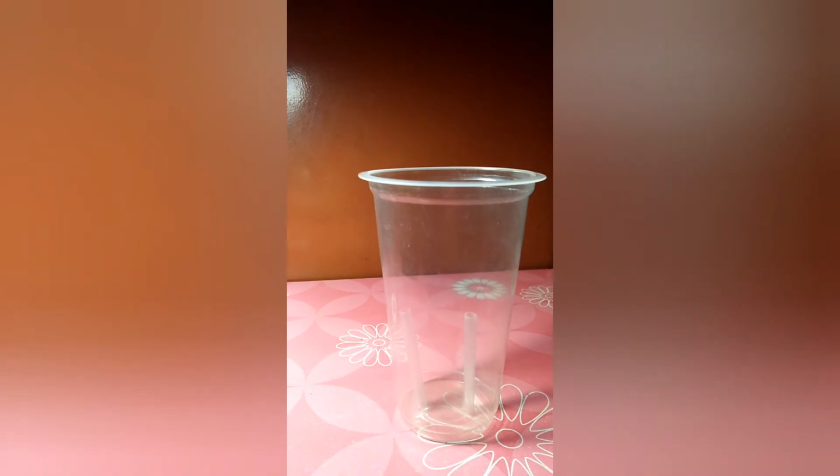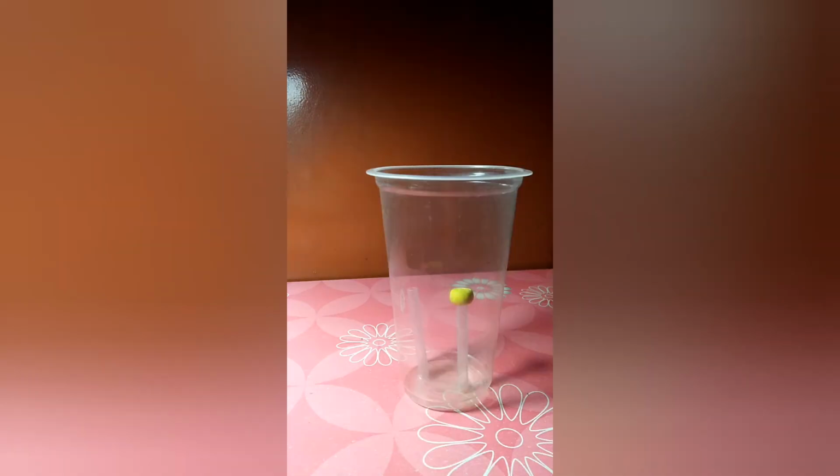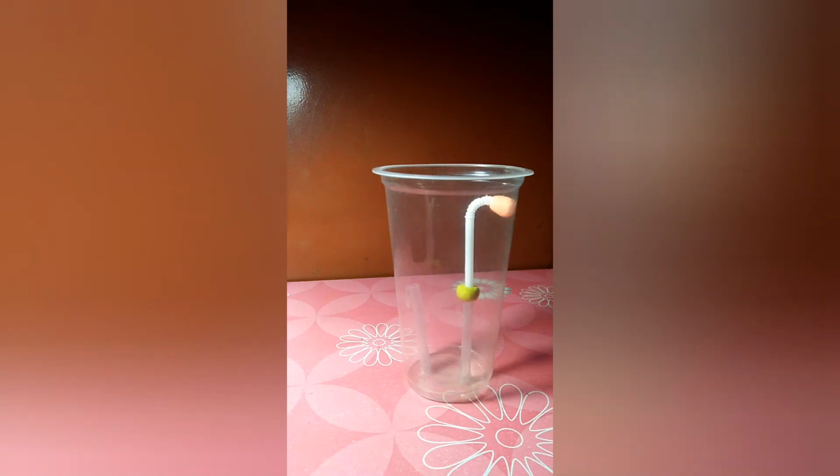The third type of ELISA is sandwich ELISA, which is used to detect the antigen in the bloodstream. Now here the well contains antibodies adhered to it. Now we add the serum which contains antigen and it specifically binds to the primary, or you can say capture antibody.